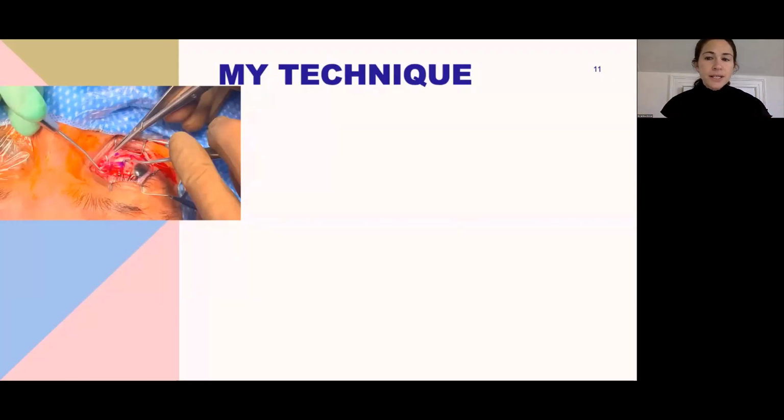And so you can see in this photograph, I have 2 green hooks in the muscle. You can use 2 Jamisons as well. It's important that the posterior hook doesn't pull too high up to the ceiling. We don't want to stretch the superficial muscle fibers more than the posterior muscle fibers. So you just kind of want to create an even plane of the muscle, and then mark.